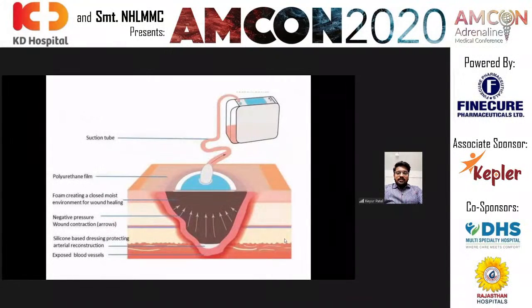In the picture, we can see a wound extending into the deeper tissues. A foam is applied over the wound, covering it, and it is attached to a drain which is connected to the suction device. So with the help of the negative pressure, there is continuous suction of the serous fluids and collection into the suction device. Next.